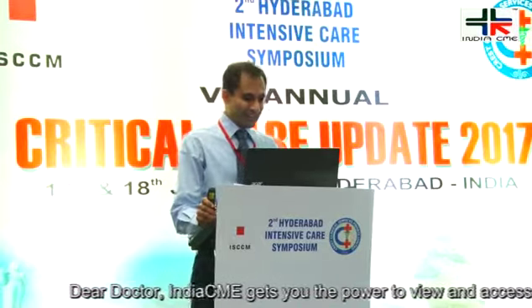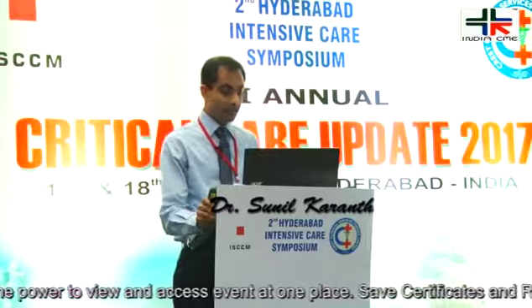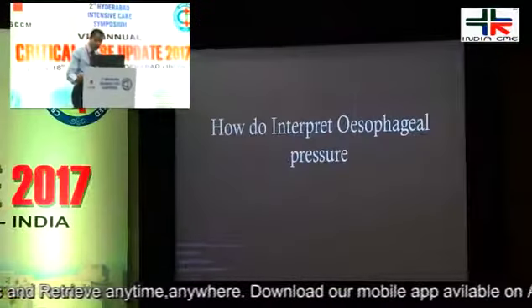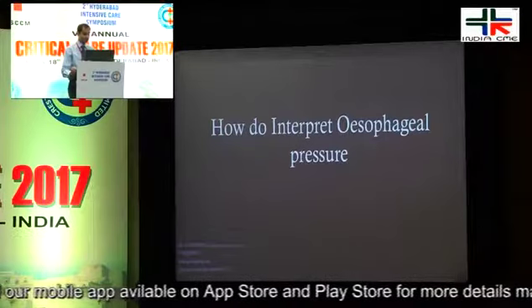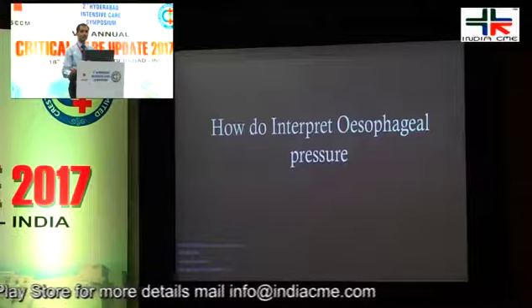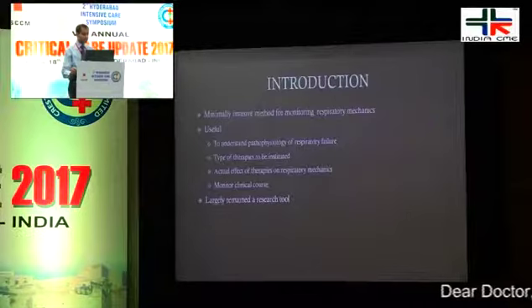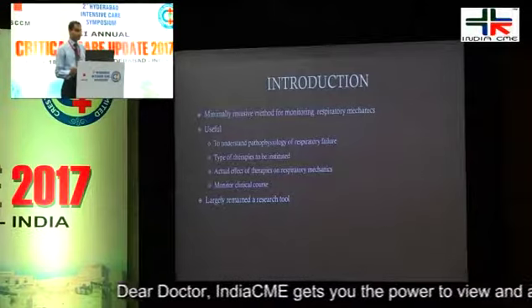All right. Good afternoon. So, coming to the last few talks, I'll be talking on how you interpret esophageal pressure, using it as a monitoring tool in the ICU for patients who have various forms of respiratory distress on mechanical ventilation, spontaneously breathing, etc. Now, this will be a summary of different physiological things that we have been discussing right through the afternoon, and possibly also going beyond the lab to its clinical application. Esophageal pressure monitoring is a minimally invasive method for monitoring respiratory mechanics.